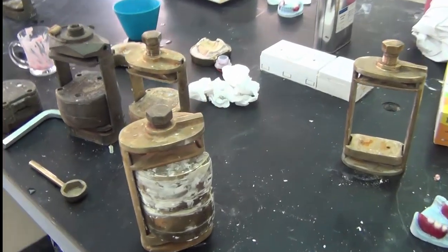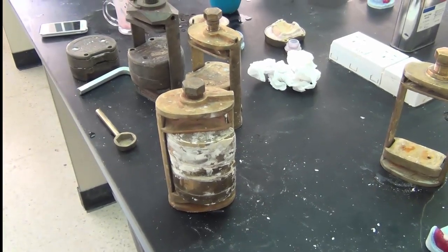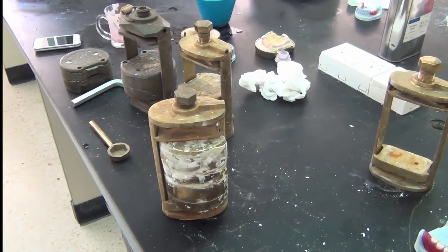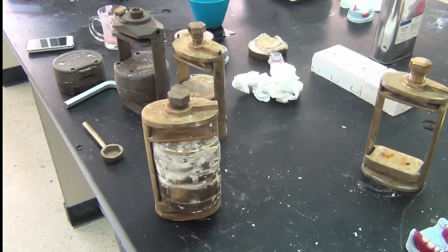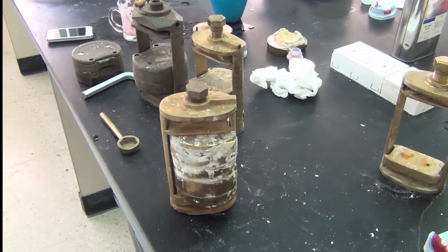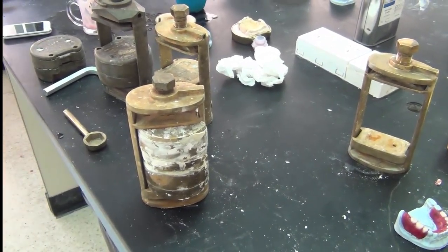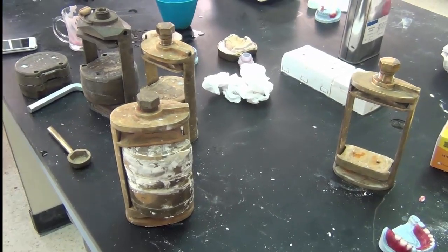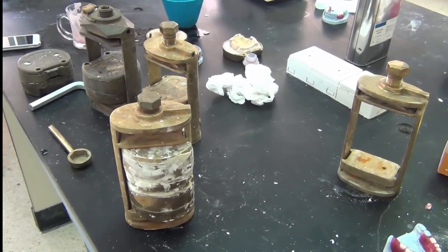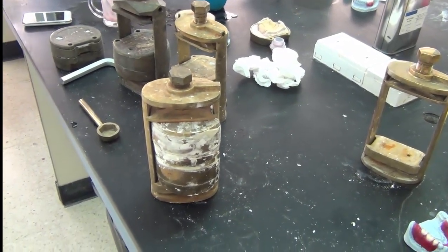So it maintains the pressure during the curing, and this will maintain the acrylic during the expansion cycles of the curing cycle. You know that acrylic expands and contracts. So during the expansion and then later contraction during the polymerization stage, it maintains that the flask is closed under pressure. So the net result is the acrylic almost exactly in dimensions similar to what we need. It doesn't allow for any excess expansion. And once the contraction of the polymerization begins, the excess pressure maintains excess material inside that compensates for the shrinkage as well. So this is now ready to be placed in the curing machine.